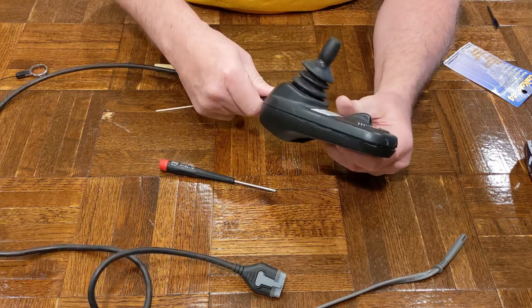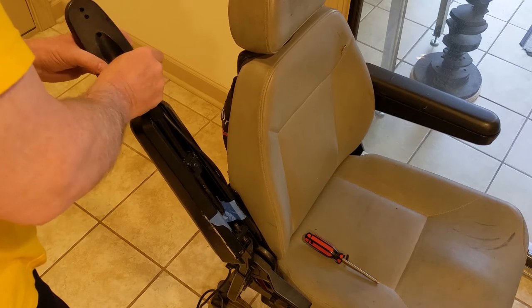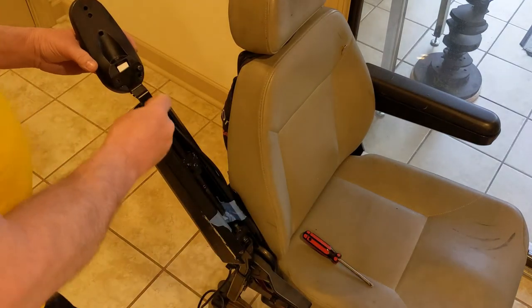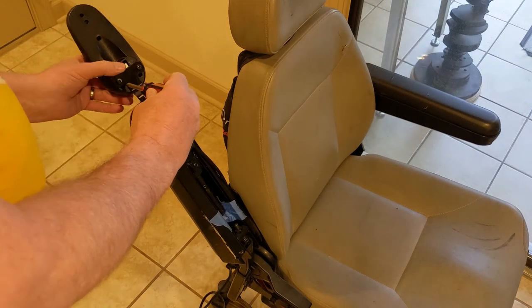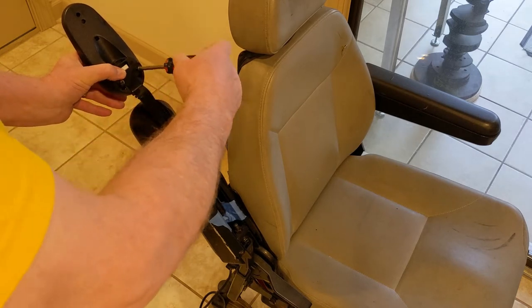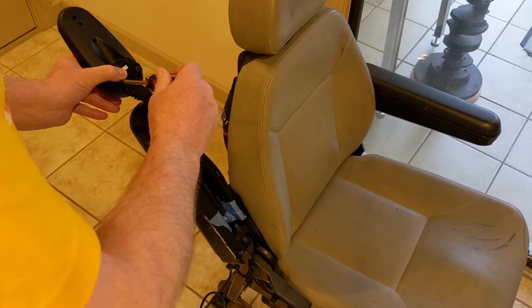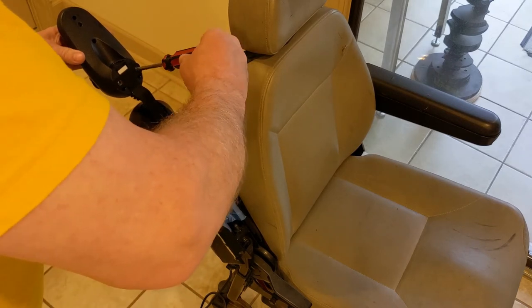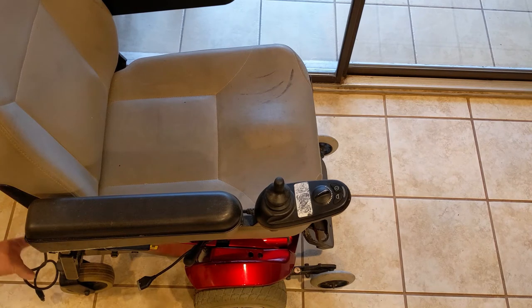Now it's ready to go back on the machine and we'll see if it works. I'm going to install the controller back on its mount. This is a number two Phillips driver here — now I can plug it in and let's see if it's going to work.